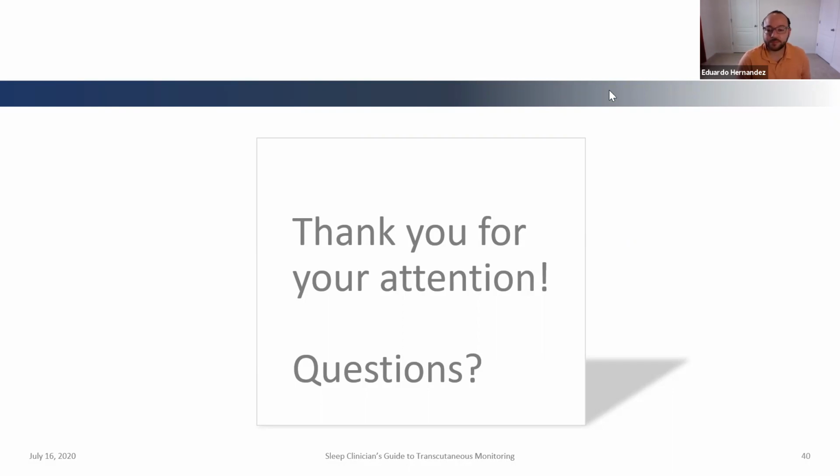Yeah, good point. I have a question, and I just typed a message back to this person. They asked if the sensor changes from blue to black or black to blue when it's time to be changed. That is definitely not something that our technology has as far as an indicator. I can't go back up and see the rest of that question, so you might just send us a message offline and we'll answer that more, but we don't have any kind of indicator on the sensor that says it needs a new membrane. Our indicator is on the display of the monitor, and it will say membrane change due in X amount of days.